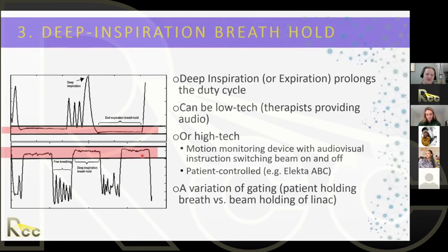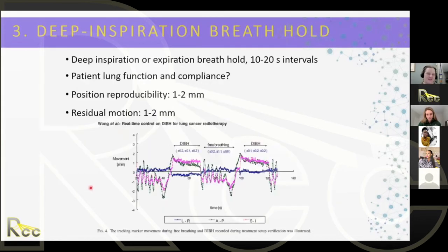However, most patients honestly have an easier time holding their breath on inhale. It's just physiologically much better for our brains. If somebody tells you hold your breath, you inhale and hold your breath. So we always use the deep inspiration breath hold nowadays.